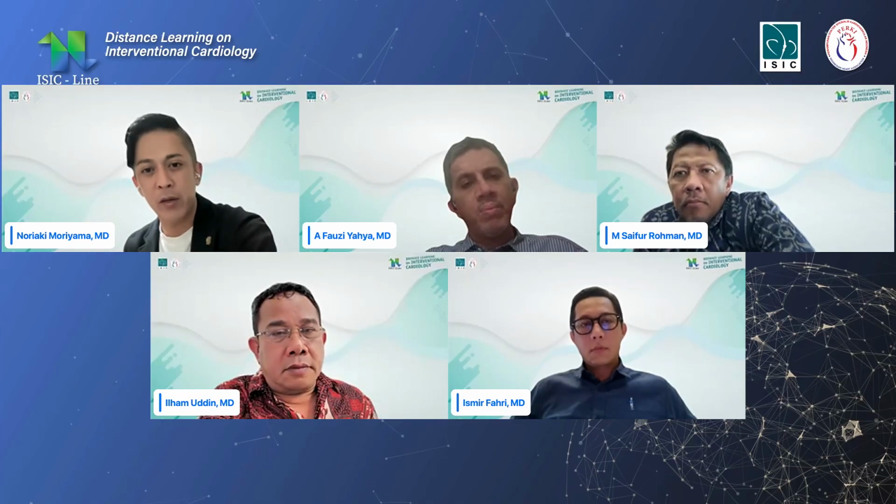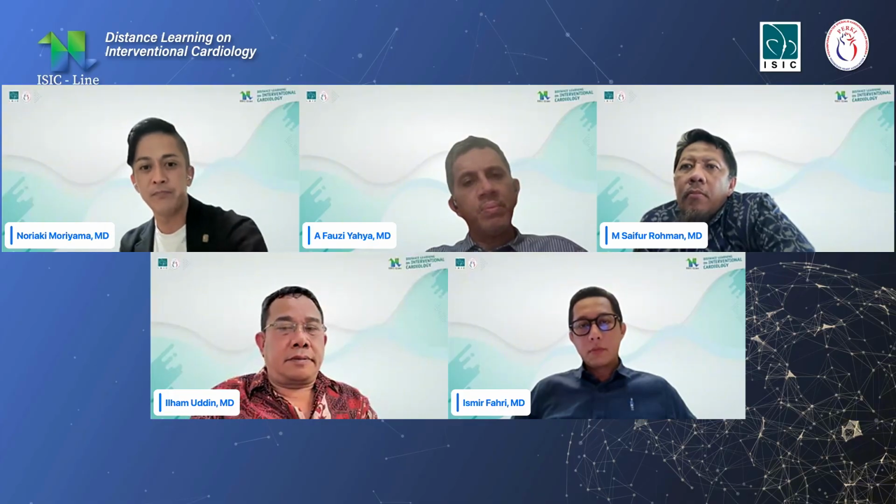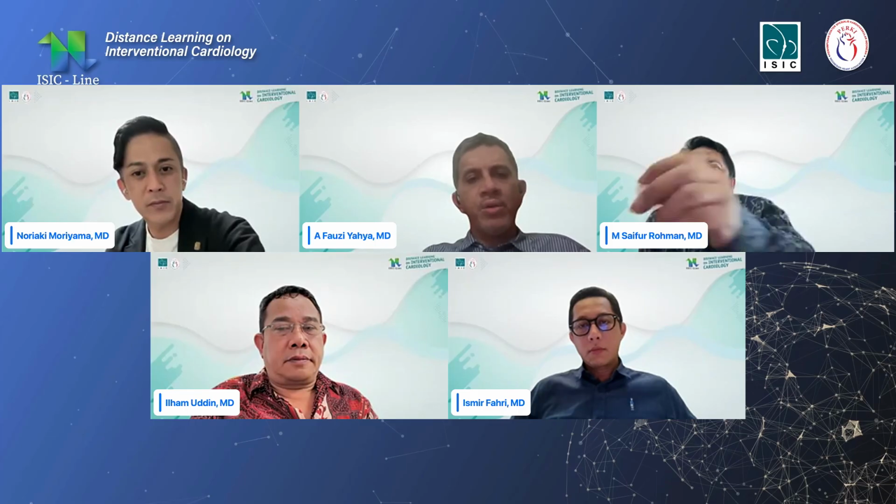This is one of the options, I think, dextran or normal saline flush. This is enough to eliminate the blood cells to get a clear vision. Okay, thank you very much.